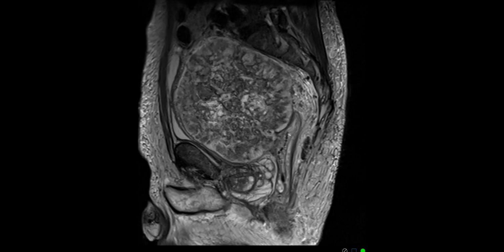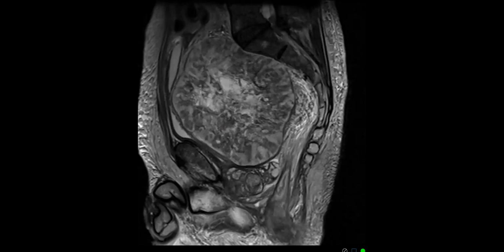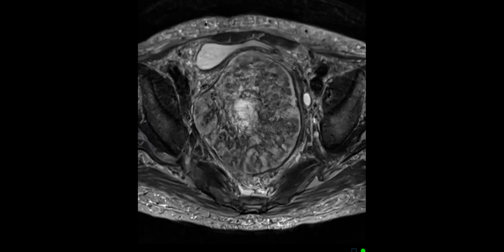The good thing is, though it's malignant, maybe it's a low-grade malignancy, because by the time it's so big, there are no mets or anything aggressive adjacent to it. It does look like a little bit of mass effect on the left ureter though. That's probably not definitely causing any problem with the bladder, like you'd have to pee a lot. Actually, this was done a few months ago, but now the patient has bilateral nephrostomy tubes. So yeah, that makes total sense. It has some mass effect on the bilateral ureters.